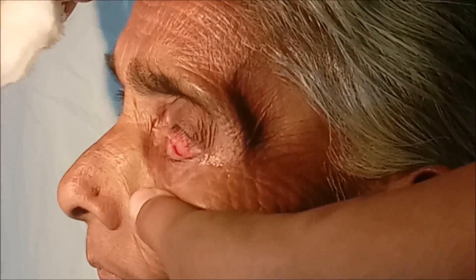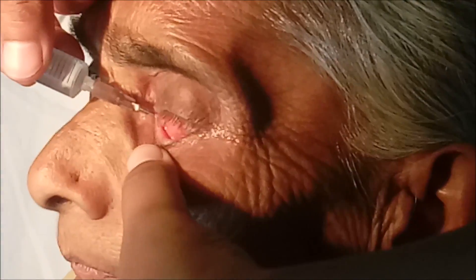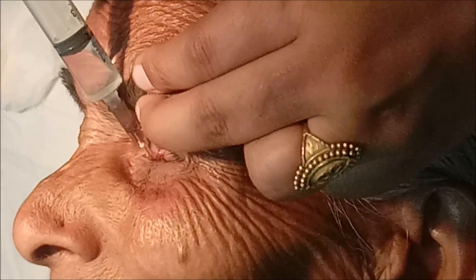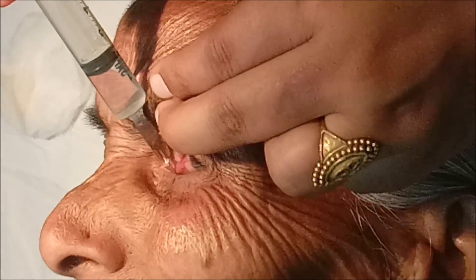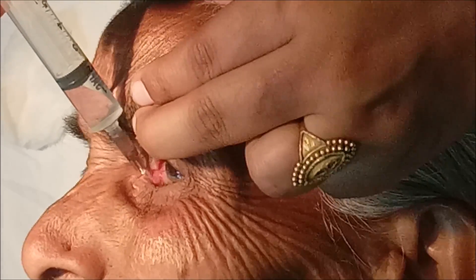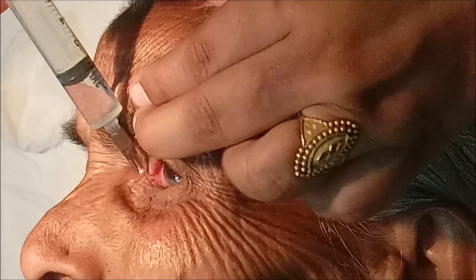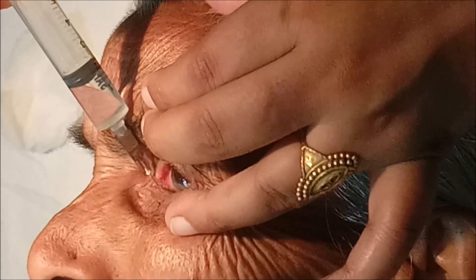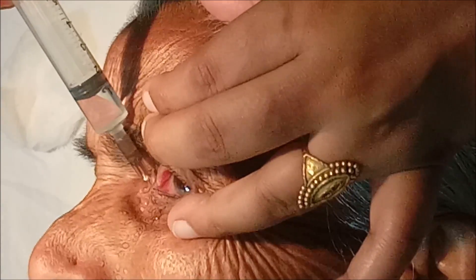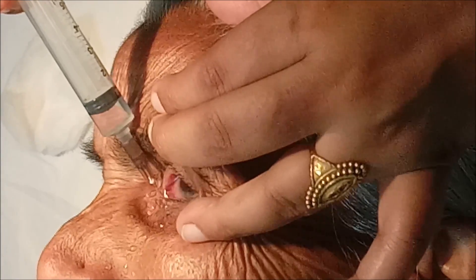I'm going to tell you something about lacrimal syringing, or the irrigation test, which is performed before doing cataract surgery — to check for any chronic dacryocystitis, to check the patency of the nasolacrimal duct, to put dye in the nasolacrimal duct for X-ray of this system, and to flush out any debris present in the nasolacrimal duct.